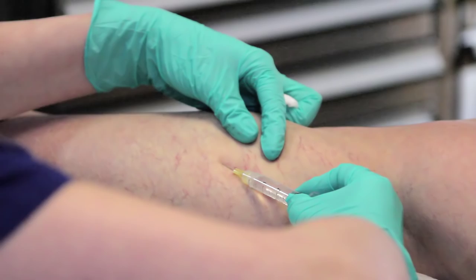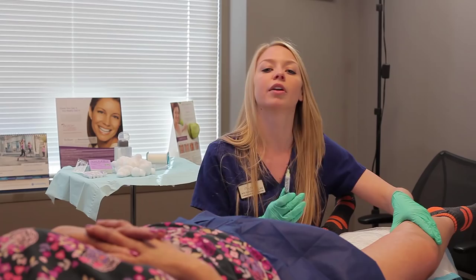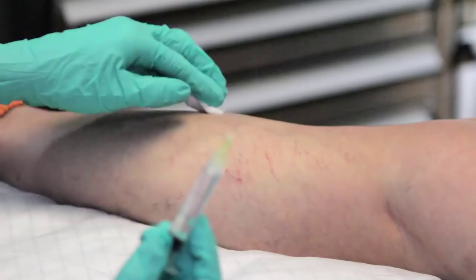Afterwards the patient typically doesn't have much downtime. Frances will notice her spider veins looking a little bit worse before they look better. So they'll look a little red, a little angry, a little bit worse off than actually when we started.